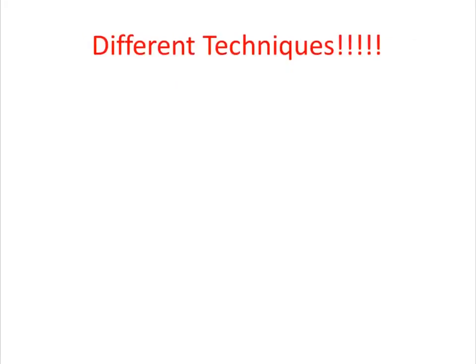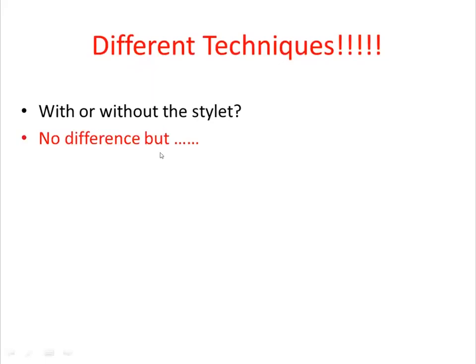Okay, now coming to the last part of the lecture, what are the different techniques of EUS tissue sampling? There are many points to be raised. The first point, do you use the stylet or not? Most of the articles show no difference if you use the stylet or not. But I prefer to use the stylet to prevent contamination of the sample by the gastrointestinal wall.